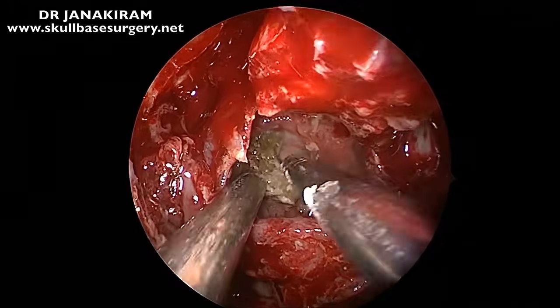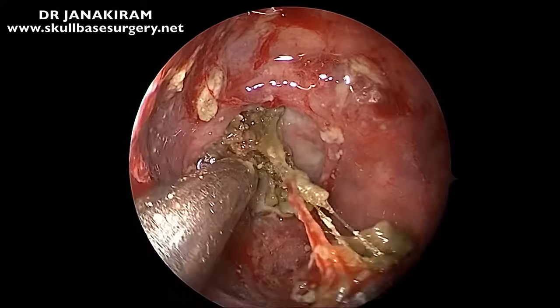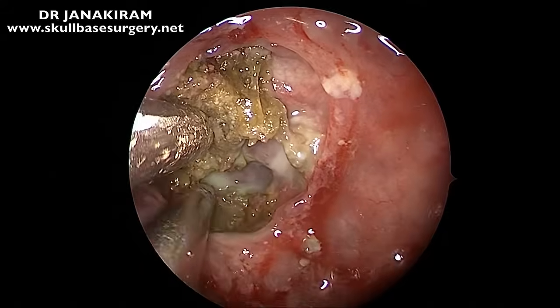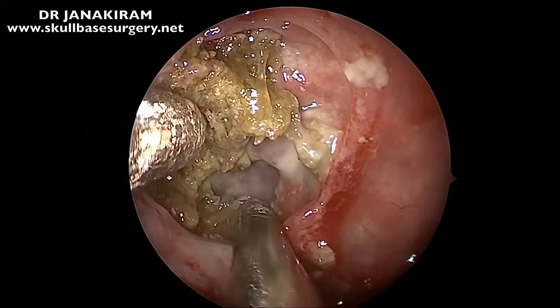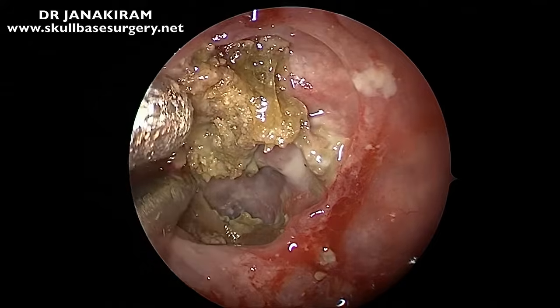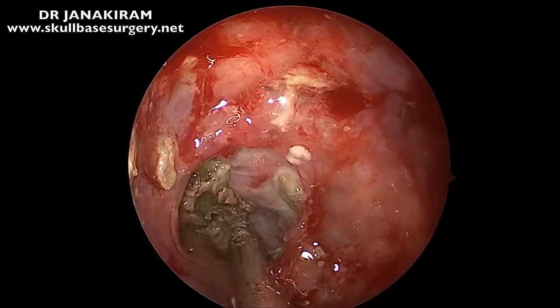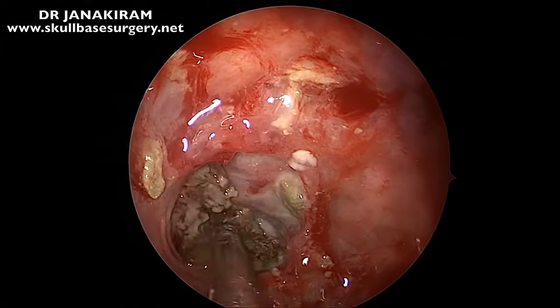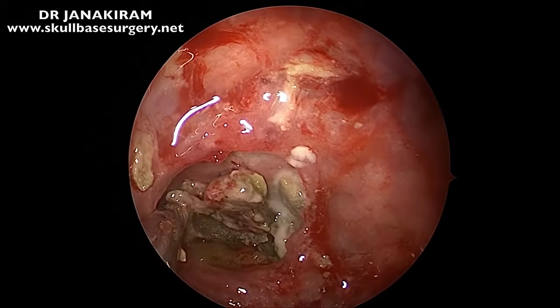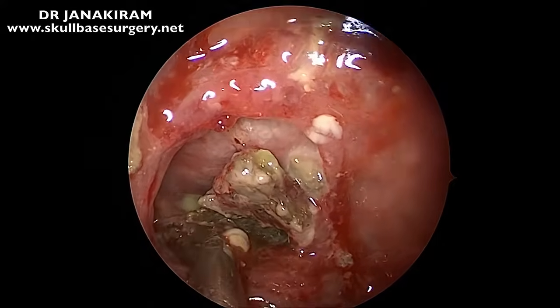You can see the fungal mass in the clival recess. We're now using a suction to clear the clival recess there. You can also see the pulsations already in the suprasellar region as well as the sella, completely deficient of bone, typical of allergic fungal rhinosinusitis here.